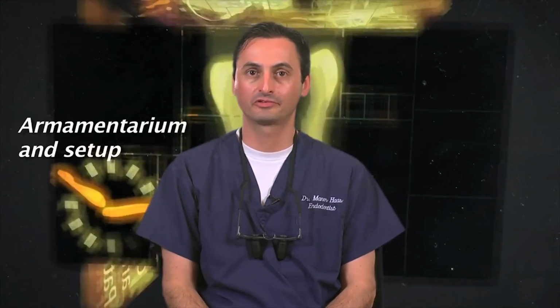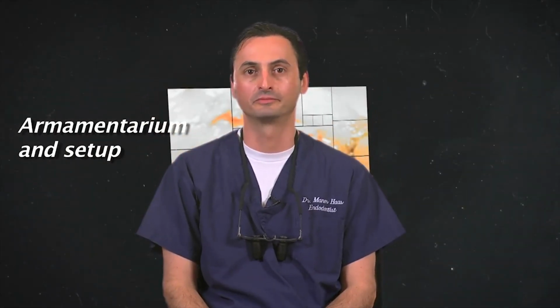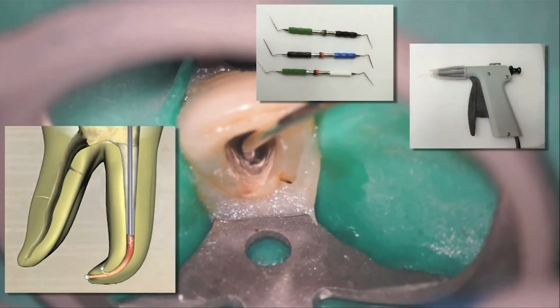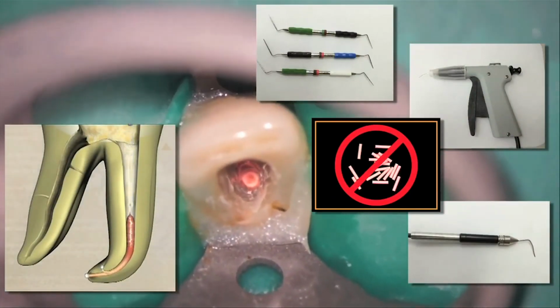A final misconception I'd like to discuss is that GuttaCore requires extensive setup and armamentarium. This is actually quite the opposite. Let me point out what is required for traditional warm vertical obturation. You need a master gutta percha cone, multiple pluggers, a warm obturation delivery unit with the gutta percha pellets or carpules, and hot tip instruments. Now compare this with what is needed for GuttaCore obturation: an oven, a GuttaCore cone, and a cotton plier.